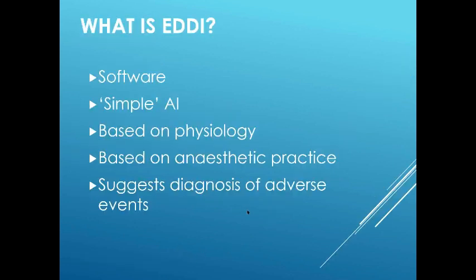EDDI is software. It needs no special electronic box or disposables. It is what I term a simple form of artificial intelligence. It is based on if-then rules and is fully deterministic. It is not a black box where the internal data pathways are unknown.